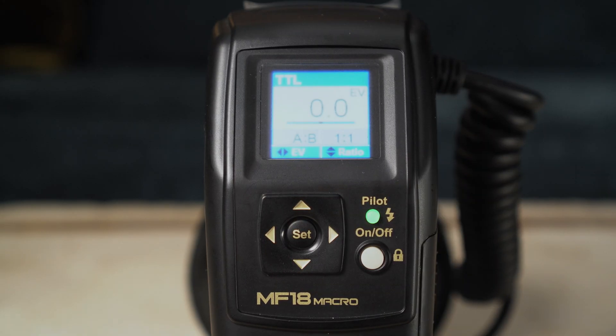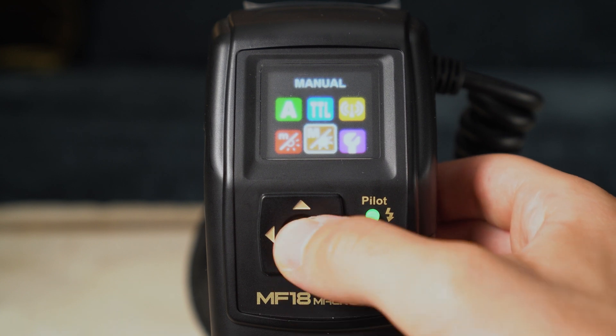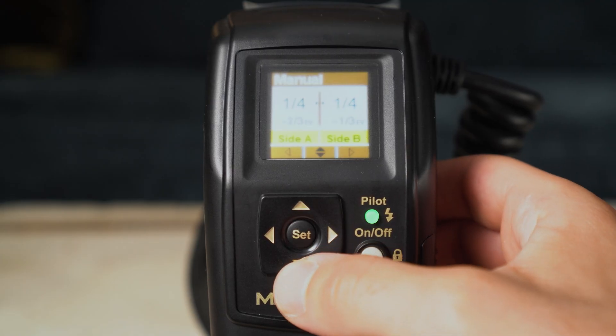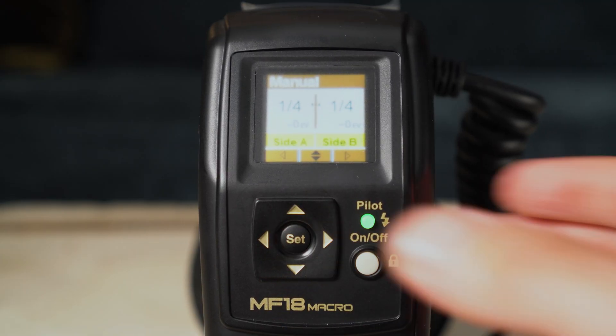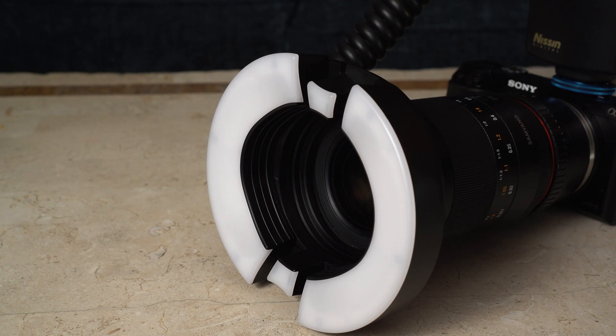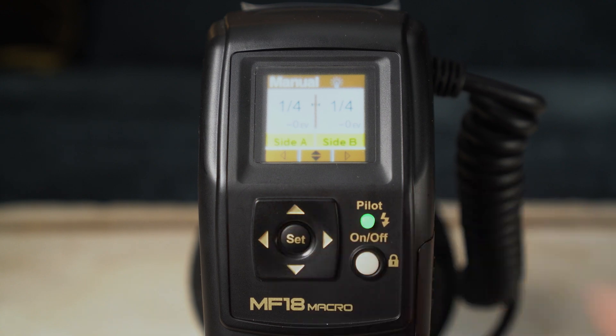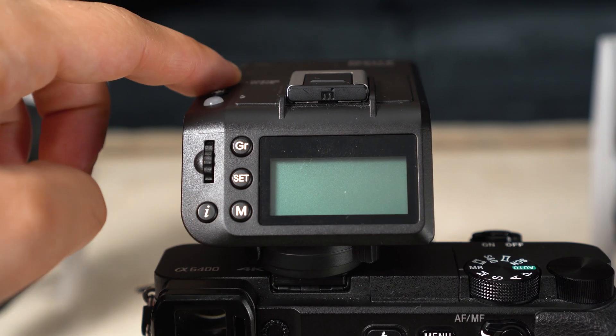For the Nissin ring flash settings: use TTL mode when taking portraits, and manual mode for intraoral photographs. For manual mode, I recommend starting at quarter power — if the shot is too bright, bring it down to one-eighth; if too dark, bring it up to half. Always have the modeling light on when taking photos — you turn it on by holding down the Set button.